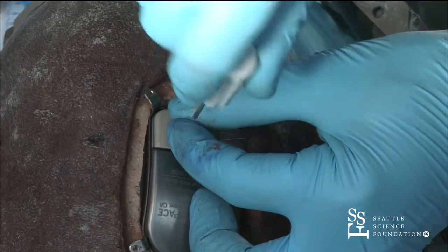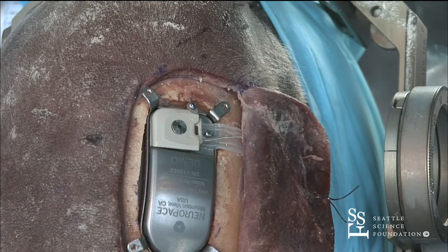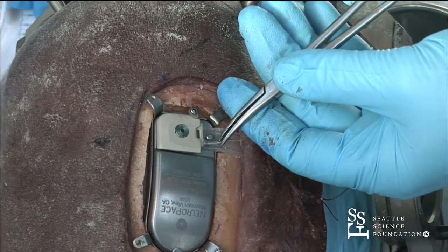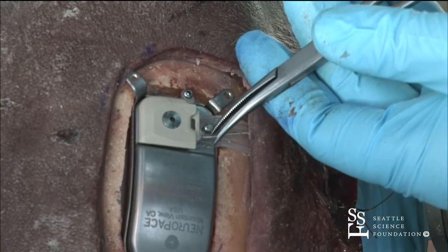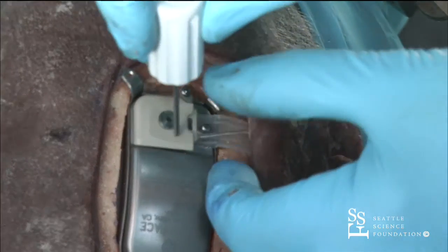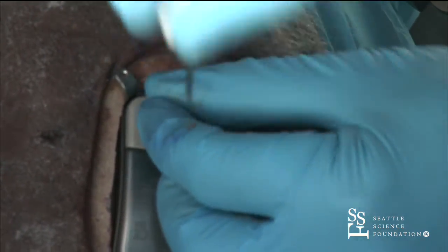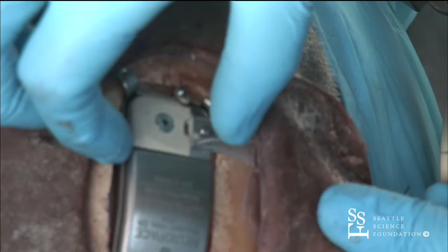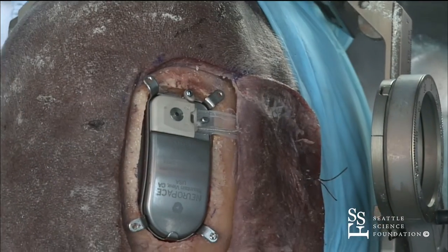And also, what you probably can't see here is that on each electrode is a little amber line, and when you come back up here later afterwards, I don't know if you can see it. Oh, nice. Almost. Anyway, when it's fully engaged, the amber line is right up flush with this cap, and that's how you know that it's all the way in. And then you lock that down completely. And then there is a strain relief cap as well. Do we have that here?